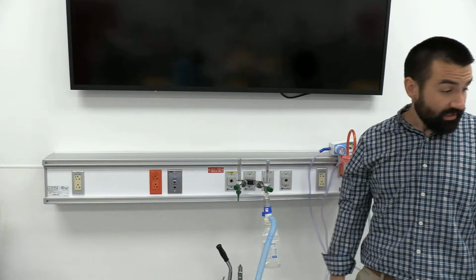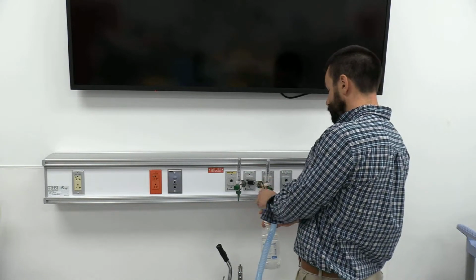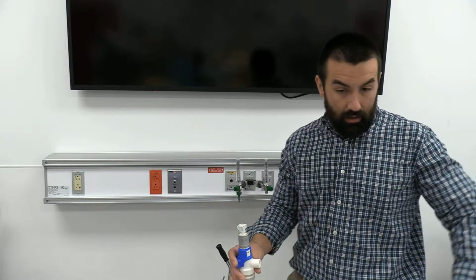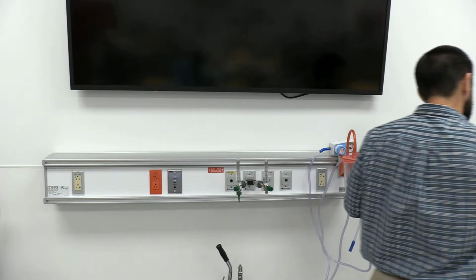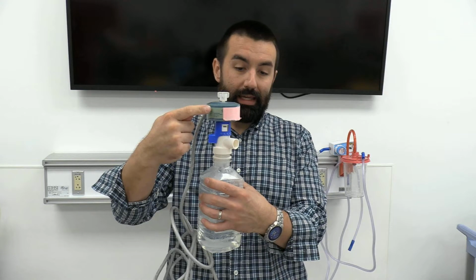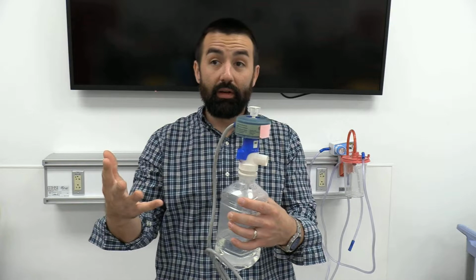So this particular design here, I'm going to go ahead and turn this off for right now. You wouldn't want to leave your patient hooked up for this. These particular ones, we use what's called a yoke heater. Nobody calls it that. It's a donut heater. And ultimately, we grab a little plug-in heater here. This slips right over the top. It heats the gas up as it's going through this device, and it can provide a little bit of heat.